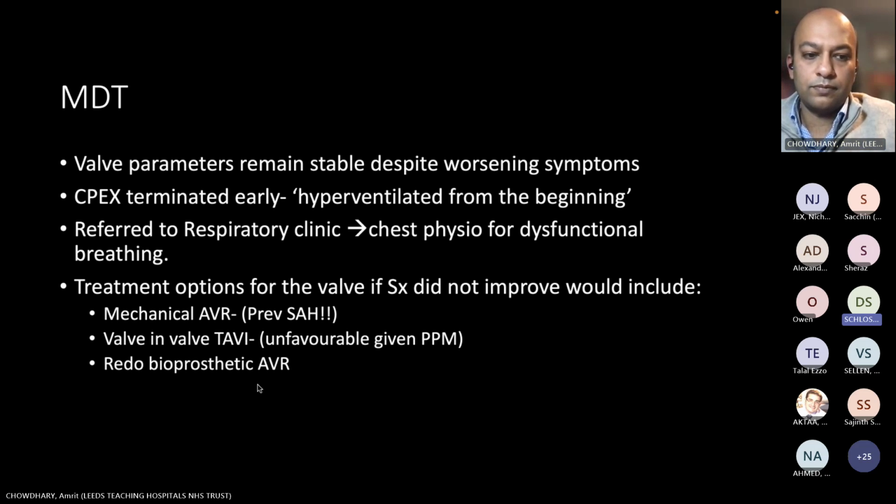If the gradients increase, it indeed can be the valve, and in her case, clinically, and that's the thing with valve disease, you have to put the clinical stuff together, not just look at the echo. And one of those echoes was a little bit of an odd one out. I would have probably looked at it. I think the TOE didn't necessarily suggest significant valve degeneration. I don't know. You show the next slide. That's the only comment I wanted to make.